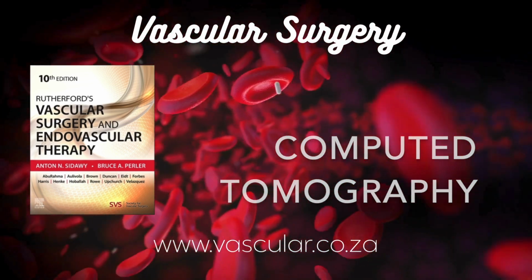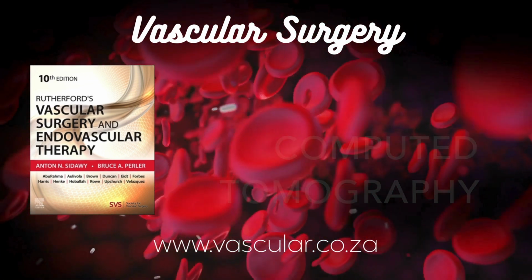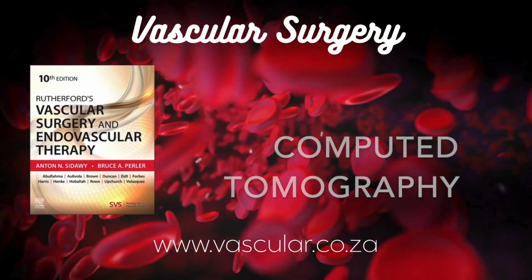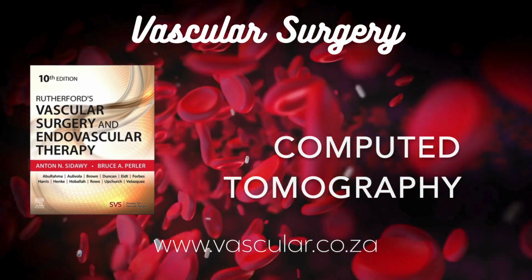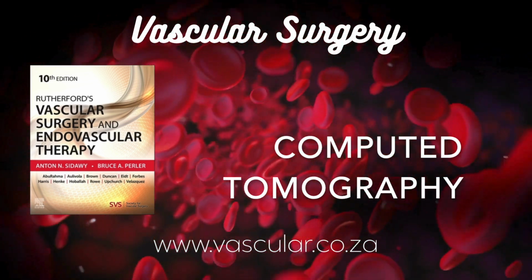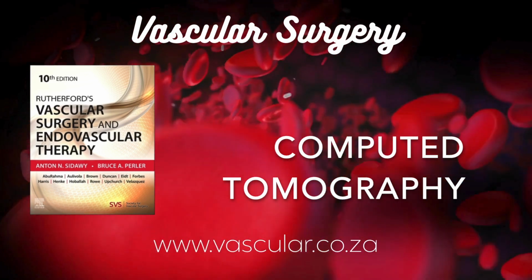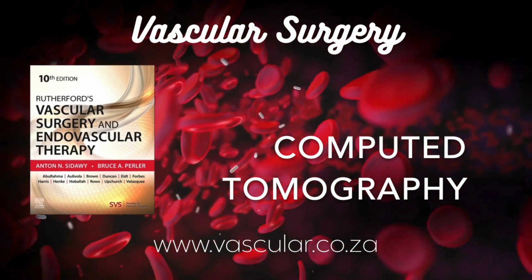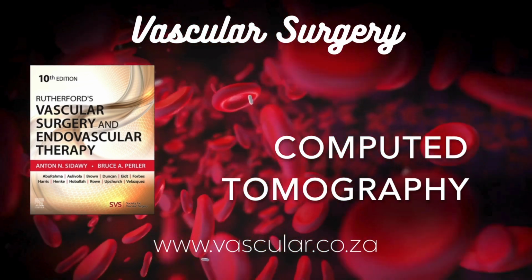Wow, that must have been way faster. Much faster. And it had other huge advantages. Because you have this continuous volume of data, you can retrospectively reconstruct images or slices at any level within that scanned volume. You could make really thin slices afterwards. Yep, very thin slices. And you could even make the slices overlap without giving the patient any extra radiation dose. That seems important. Why would you want overlapping slices? It helps create smoother, better quality 3D reconstructions later on. Now, sequential CT could do overlapping slices, but you had to physically scan each one, increasing the scan time and the radiation dose. Got it. So spiral was faster, more flexible, less dose for overlap.